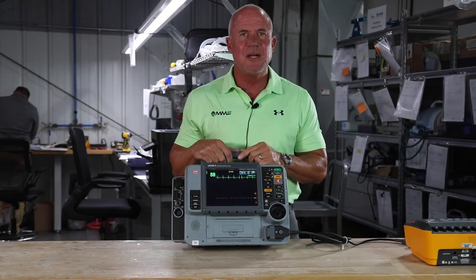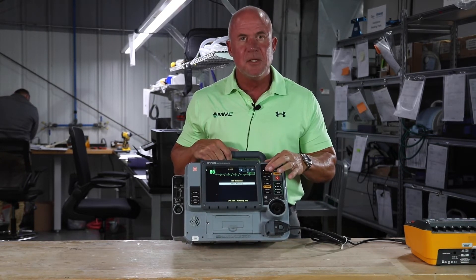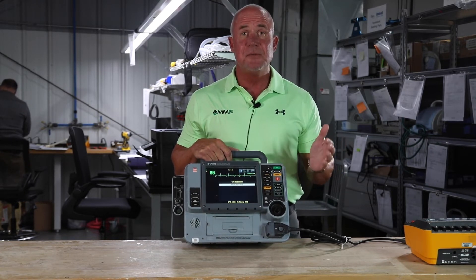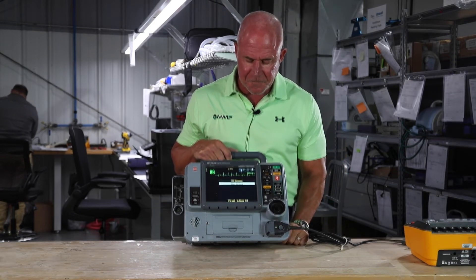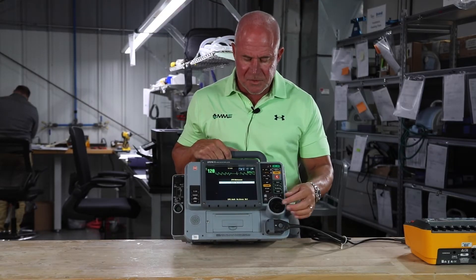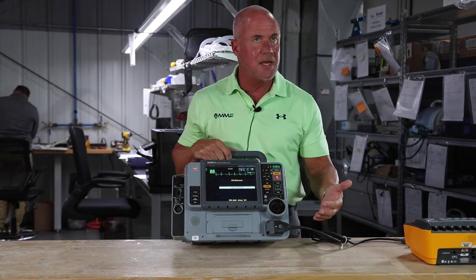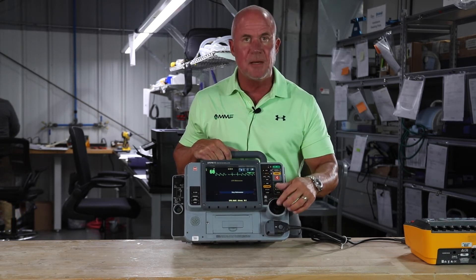One of the features that makes the LifePak 15 unique is that it includes a CPR metronome. With one push of a button you can activate the metronome, and if you can zone in to that beat, you're doing at least 100 compressions a minute. It also guides you so that you're not hyper or hypoventilating your patient. Once you get an airway on your patient, you can switch to adult with an airway. Or if you're working on a youth patient, you have two options: with or without an airway. To stop the metronome, simply press CPR and scroll down to stop metronome.